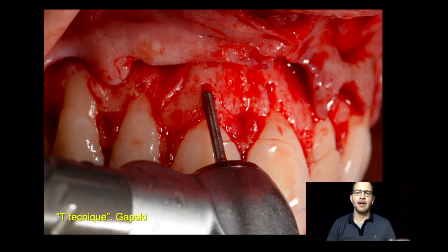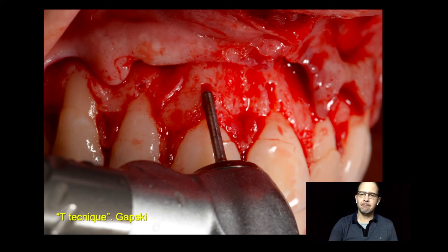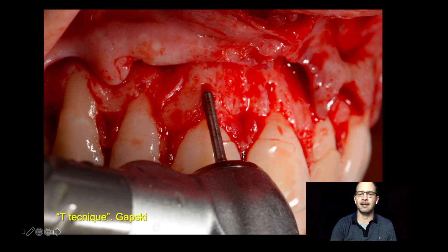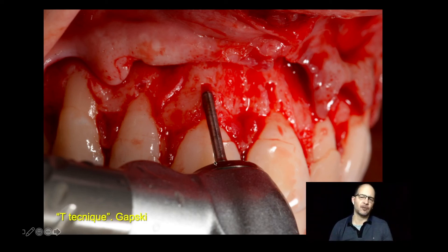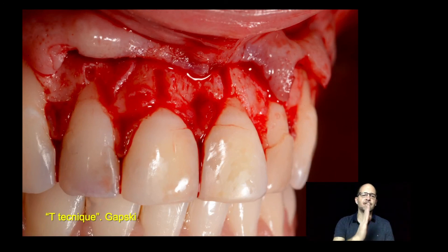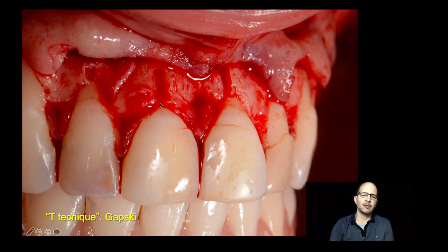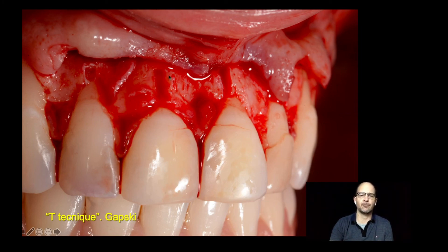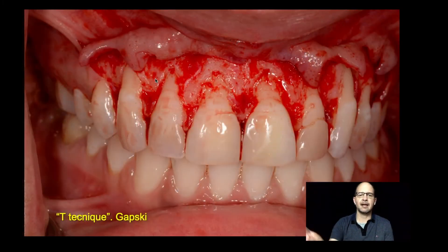What is my T-technique? It's an osseous bone bur. I replace this flap, matching the papilla because I don't cut the papilla — just taking the vestibular third. I place this flap in its final position and I start to do marks just at the buccal until I find three to four millimeters. Instead of removing little by little tooth by tooth, I end up having a mark for every tooth showing where I should go. So I do kind of a crown lengthening backwards — I know here is my biological width that I want, so I just start with a diamond bur, or chisels or whatever instruments you're comfortable with, and I come back and remove my bone.